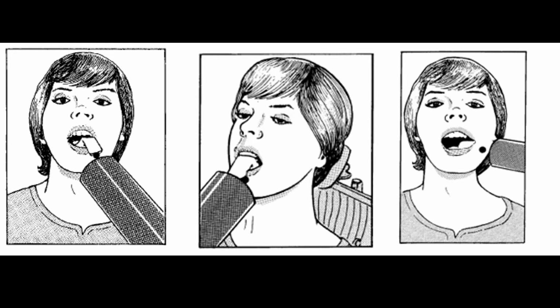When using the bisecting angle technique for mandibular exposures, the PID and central ray need to be directed to places which are located directly below the maxillary points of entry and approximately ½ inch above an imaginary line which is parallel to the lower border of the mandible.